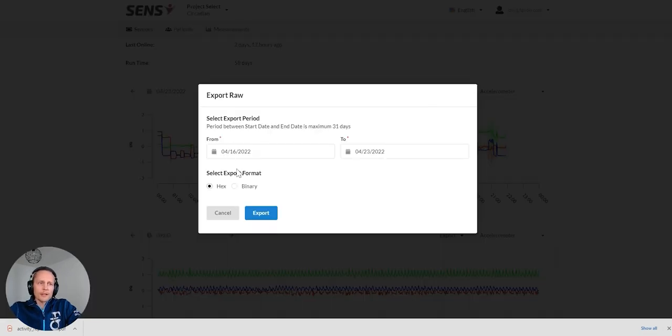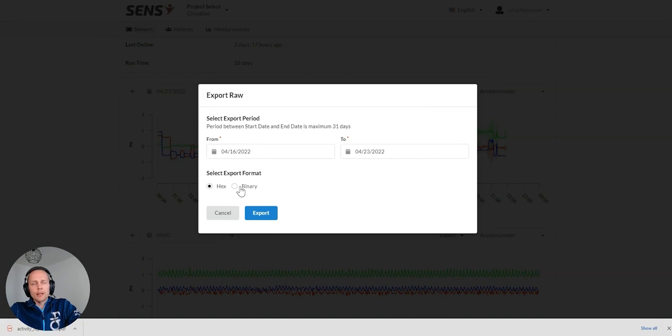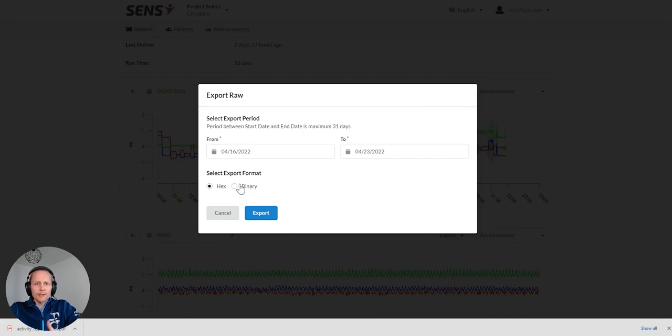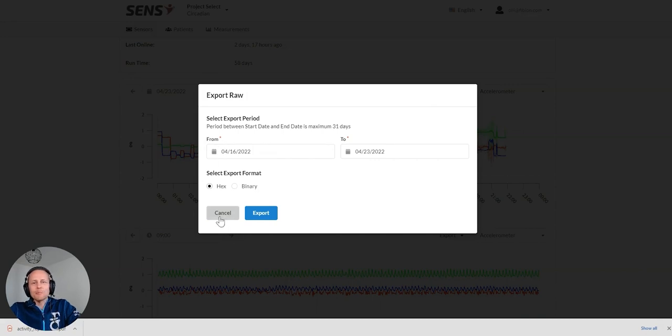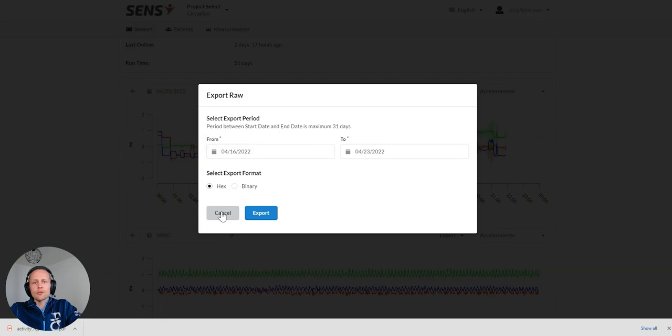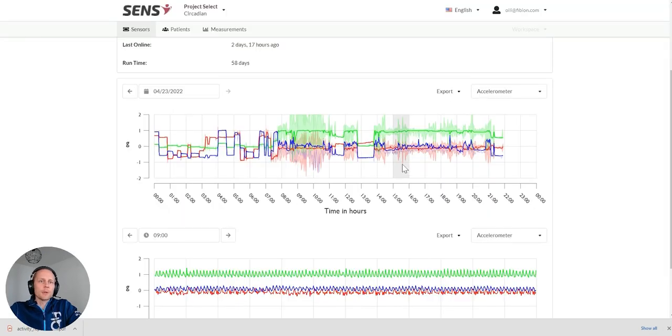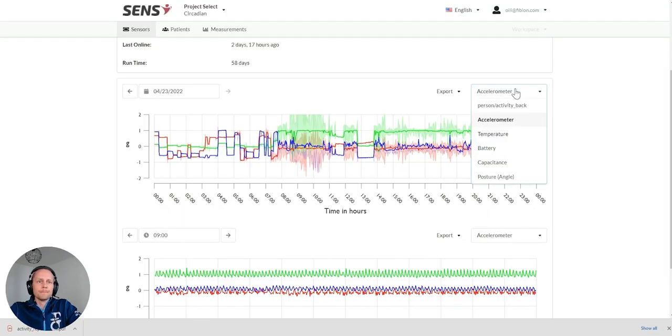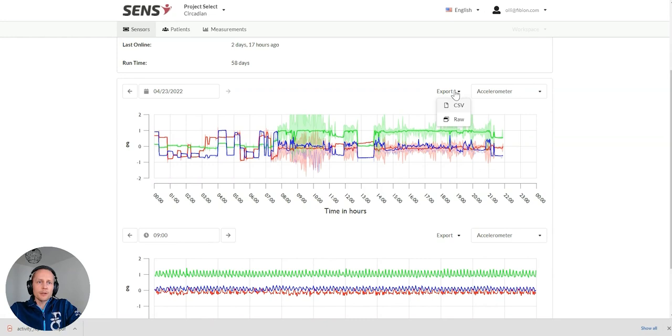For example, the raw data you can get in a binary format, which is about one-tenth of the size of the CSV file. And these tend to be usually quite a big data file, so exporting it in a binary file is a good way to save some space. It can be exported from here in different formats.